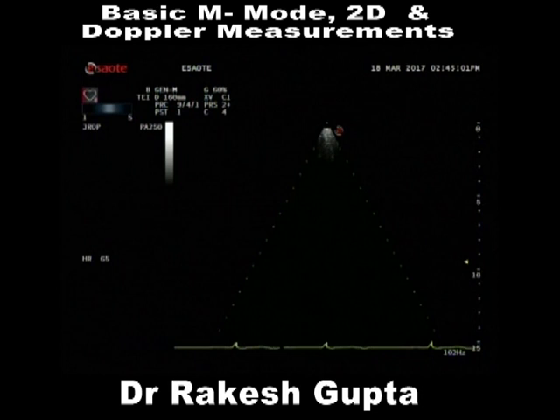Again, Ramlal, Shamlal. Higher the frame rate, higher the pixel. You got it? If you have a very high pixel camera, you will have good resolution images. If you have a higher frame rate, you have good resolution. Angle of incidence, what? The angle of incidence of what I am interrogating with the transducer to image the structure. Is there any knob to localize this? 20 degree, 30 degree? You can only zoom up that structure.